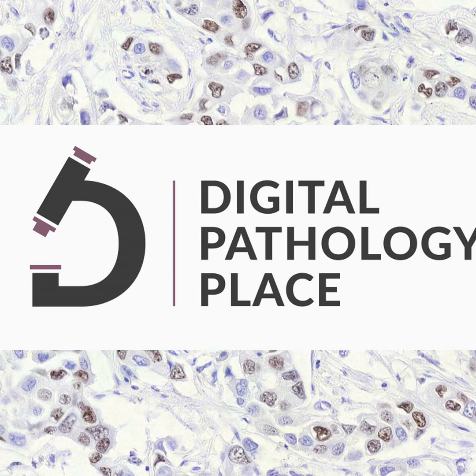Here, for the pathologist, and for the detection of intra-nodal nevi, the AUC was lower, not surprisingly, for both AI, 0.781, and dermatopathologists, which ranged from 0.63 to 0.79.